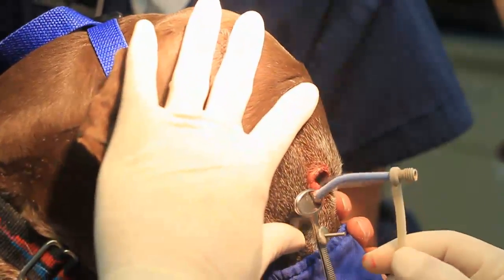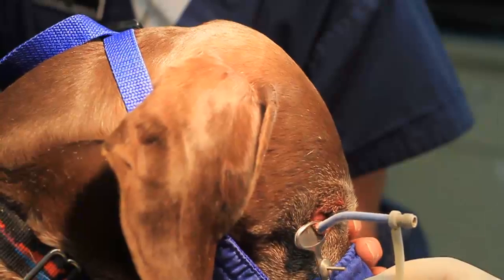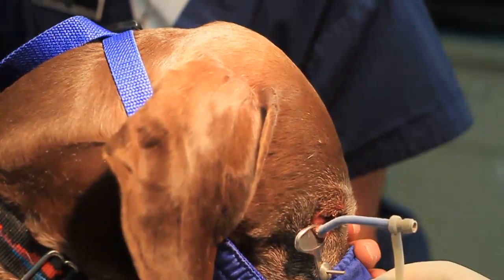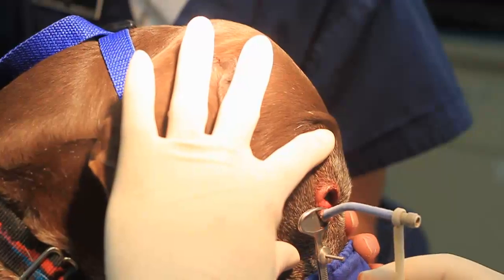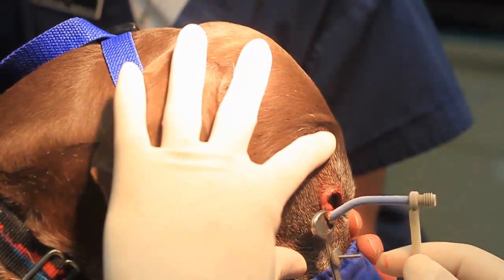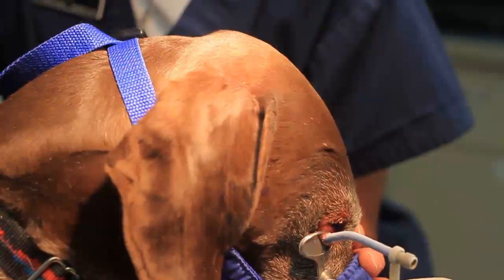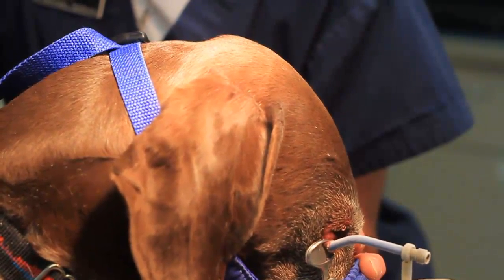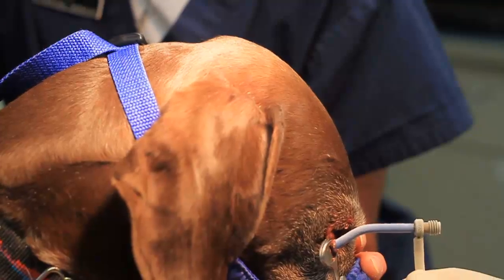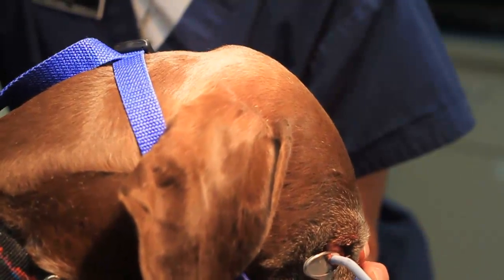If you accidentally have this flip up and touch the cornea, don't pull it off because you'll peel part of the cornea off — just let it thaw and it'll be fine. It'll scare you but it'll be fine. I've done several thousand of these and never had where I killed the cells on the other side, so I've never had a permanent defect. Some people recommend two freezes; I only do one freeze and again have less than 2% recurrence rate.